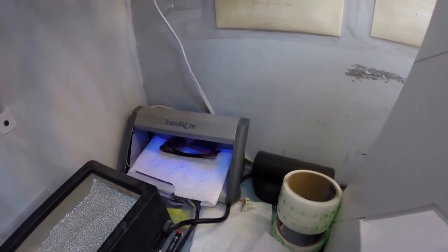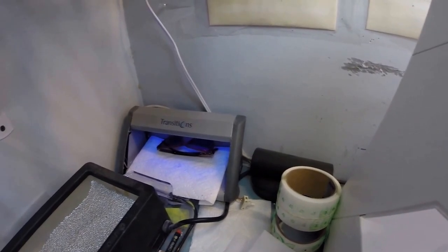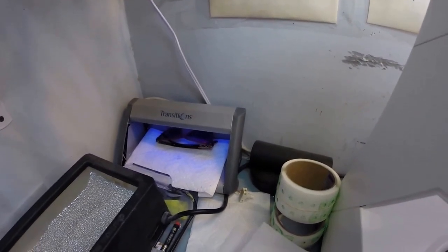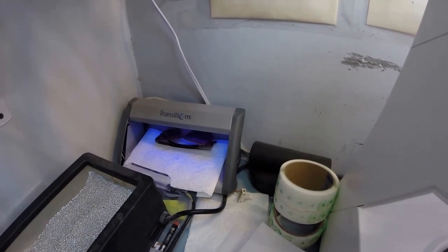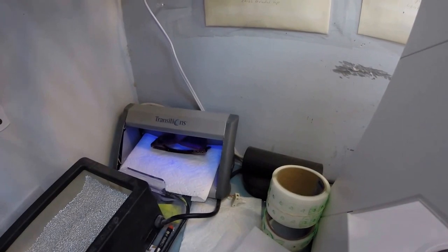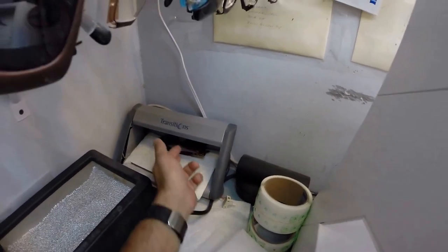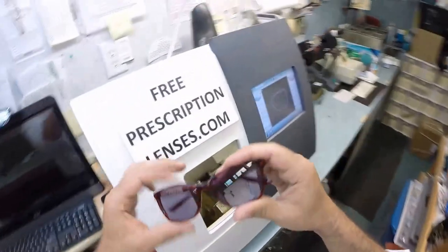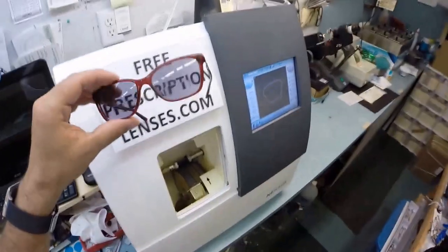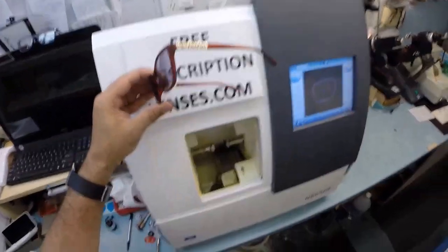Now, if you have a convertible or a motorcycle, yes. They're also temperature sensitive, meaning when it's 85 degrees and below, they will get darker than they will when it's 95 degrees and above. I like to remind everyone with the middle of summer coming that you're miserable, they're miserable when it's 100 degrees. Everyone's miserable, nobody works 100% when it's 100 degrees outside, especially here in North Carolina. But that's it, Suzy. That's the first time your lenses have been activated. Don't worry, they're going to get darker. Come on, we talked about this, Suzy.